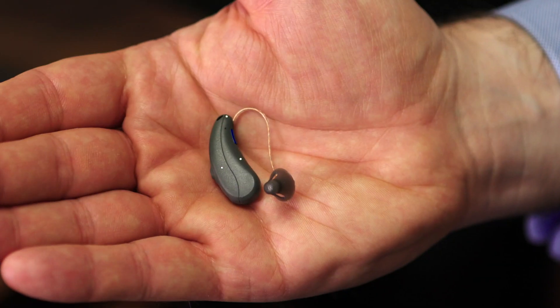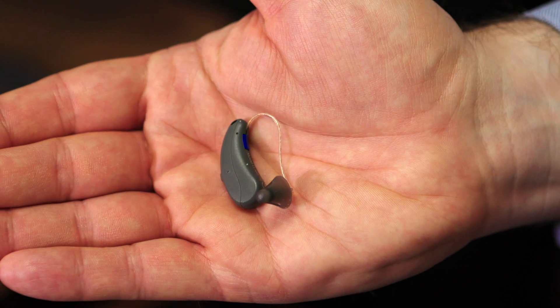Audio Service are normally known for their custom products. They've been going since the 1970s — started with custom products but have been making some fantastic receiver-in-the-canal products recently. People don't tend to know much about Audio Service as a brand, which is part of the reason we wanted to review them and raise a bit of awareness. We quite like these products.